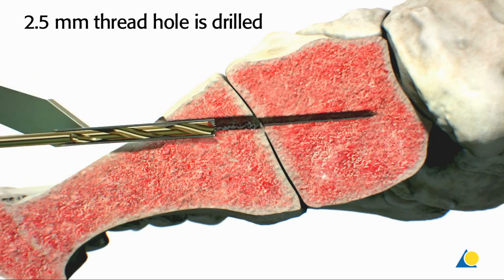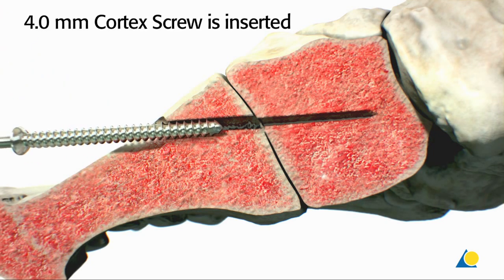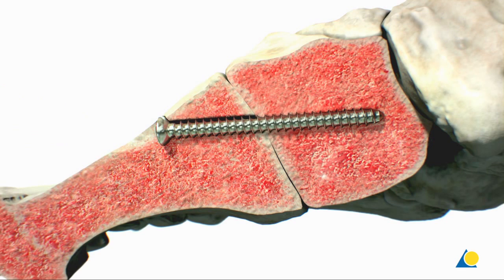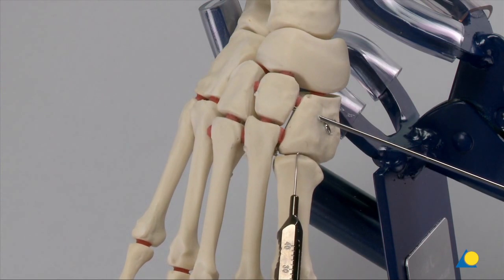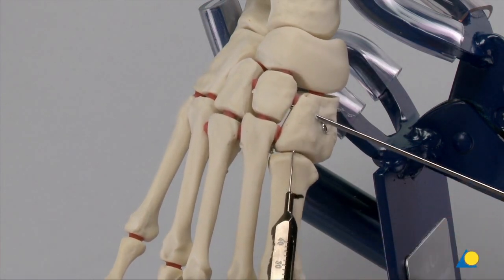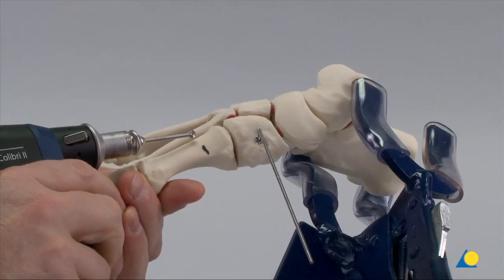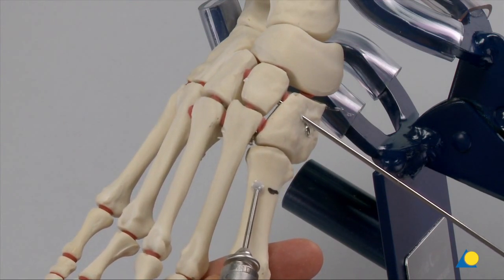Since the thread hole is smaller than the core diameter of the screw, the screw will radially push the cancellous bone outward. This differs from standard AO technique in which the thread hole is drilled to the core diameter of the screw. 2 cm are measured from the joint and marked on the bone. A burr of sufficient size to create the pocket hole is used — here, a burr of 5 mm is used.